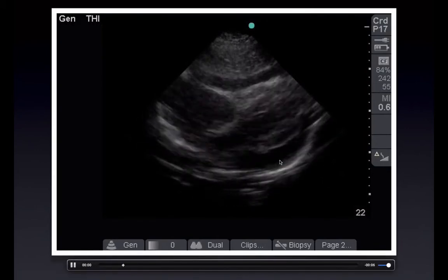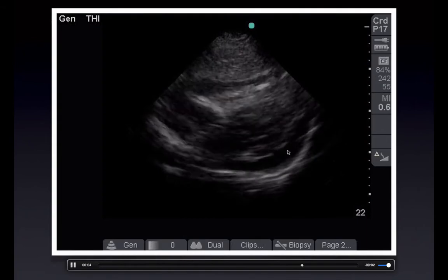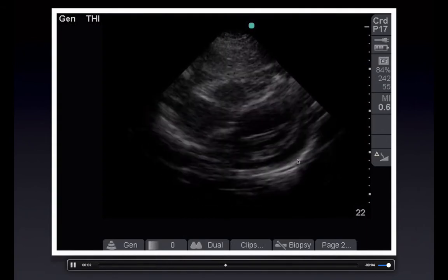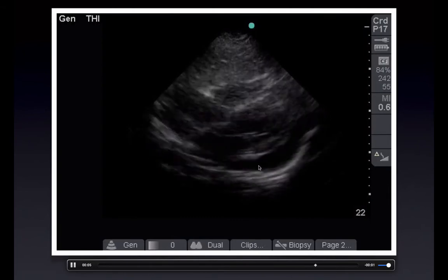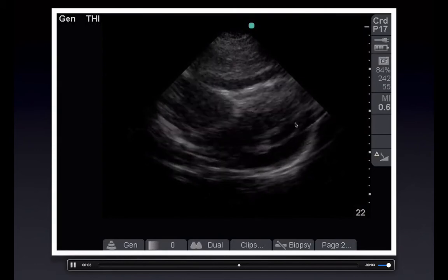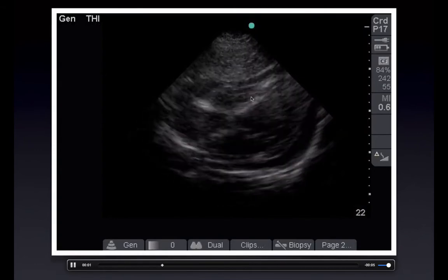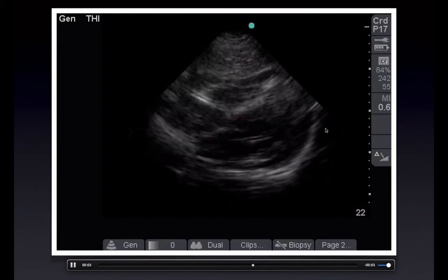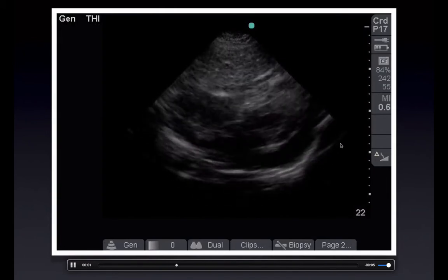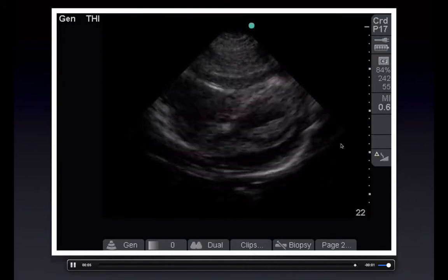Then, do we have an effusion? Well, yes, there's an area of anechoic around the heart. Your image goes all the way down to the pericardium, very important, so you're able to actually visualize. If you were scanning only up to here, you would miss that part. So what's happening with the right ventricle? The right ventricle seems to be collapsing there. So maybe tamponade. Tamponade is obviously a clinical diagnosis, but concerning looking.